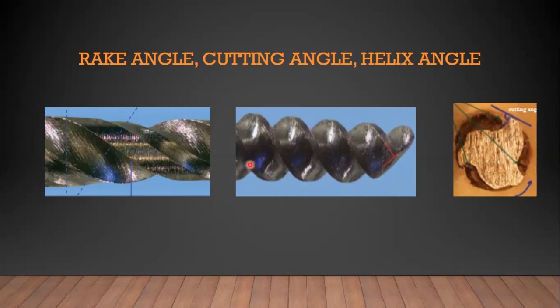If we have an increased taper from the tip towards the coronal part, the coronal part will be more rigid because it is more tapered, but we don't want that coronal part to be more rigid. So we increase the flute's depth, we increase the pitch also, and increase the depth of the grooves to make it more flexible.